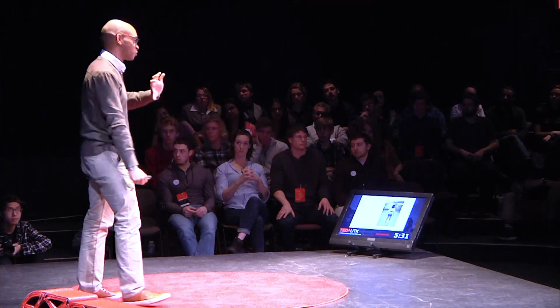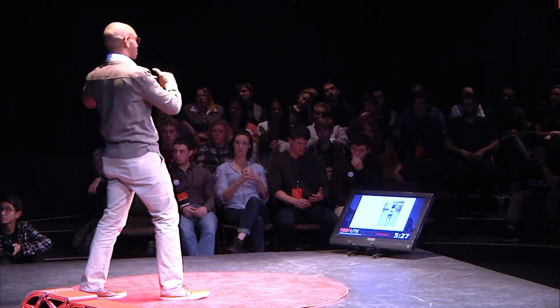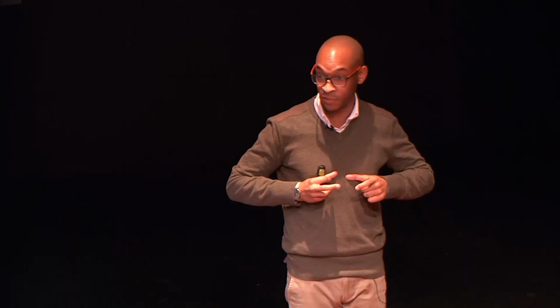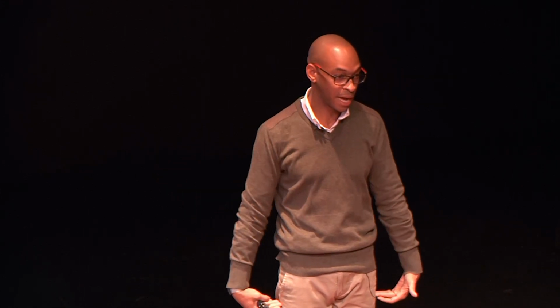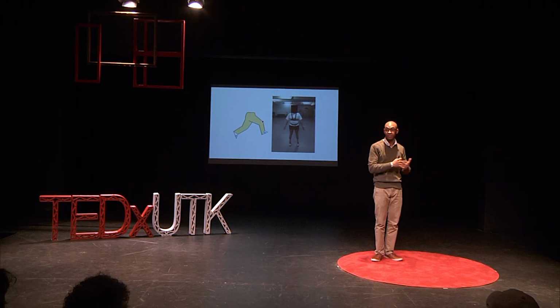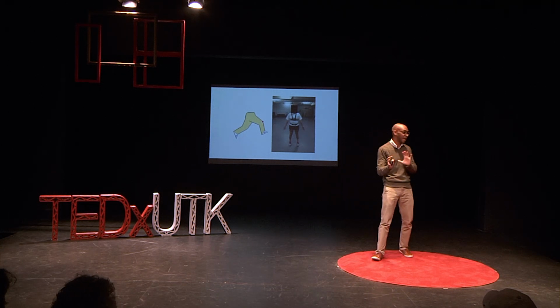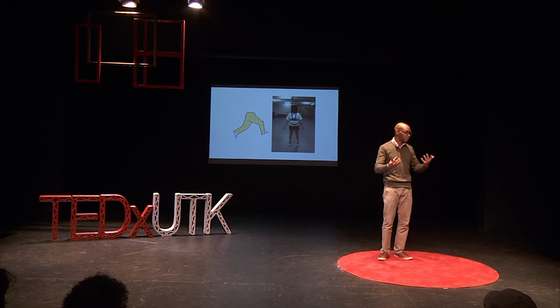Here you see an individual wearing a downward-facing camera for confidentiality reasons. We don't want to film all you guys because you wouldn't like that. But that downward-facing camera allows us to see the gait activities this individual is doing, so we can compare them to the data that we're getting for the sensors that you can see this individual is wearing on the thighs, the shanks, and on the hip. So what we've done so far is we've classified different types of activities. What we're continuing to work on is looking at those gait dynamics, gait biomechanics as the individuals walk and perform these different tasks. So this is something we're very excited about.